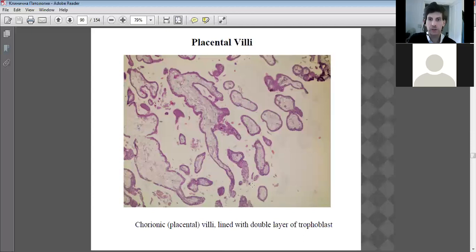And these are going to progress into the mass of the uterus and develop their more advanced blood supply. That will then allow materials to diffuse into the growing embryo. At this stage, we call it the trophoblast. So just the initial stages of development of the villi.